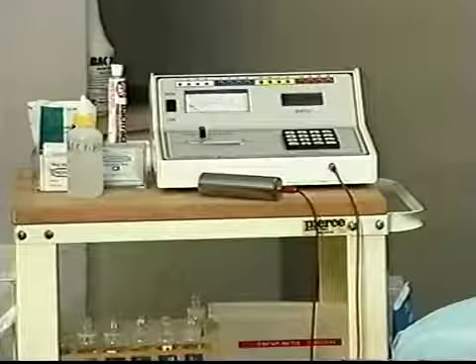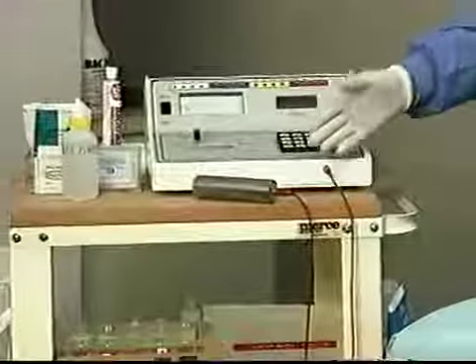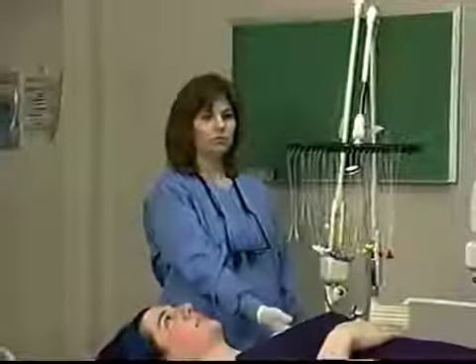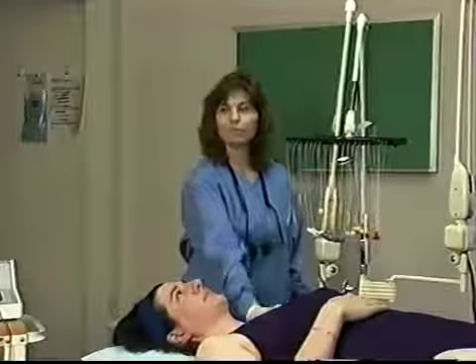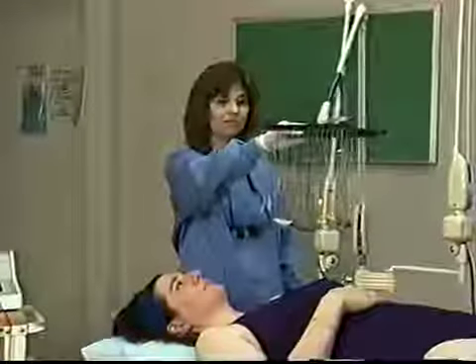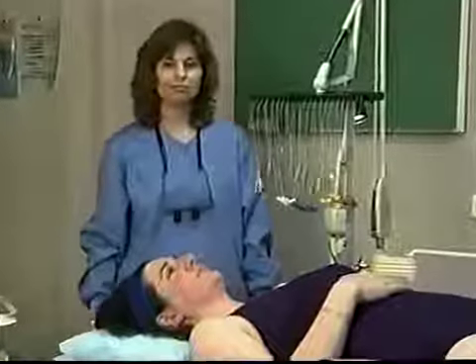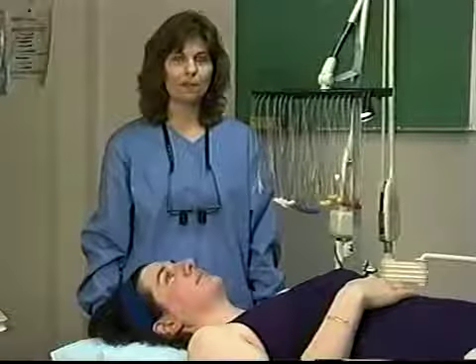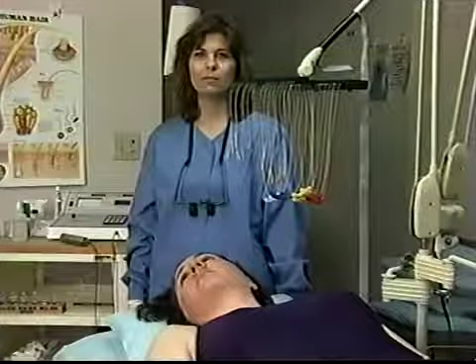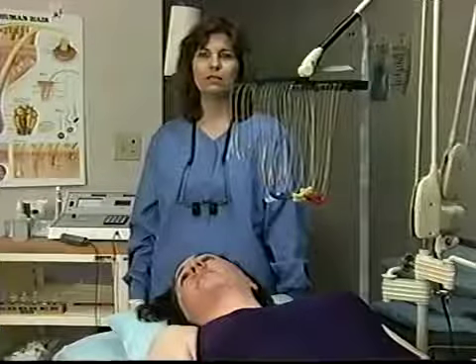The multiple needle equipment consists of a console, which generally sits on a utility table, and the needle cord rack and stand, which is placed alongside the patient. Position the needle cord arm and stand so that it is directly adjacent to the treatment site. Don't try to stretch the arm out too far. This will only interfere with your manipulations. Don't try to do the entire face at the same time. Break up the area into sections.